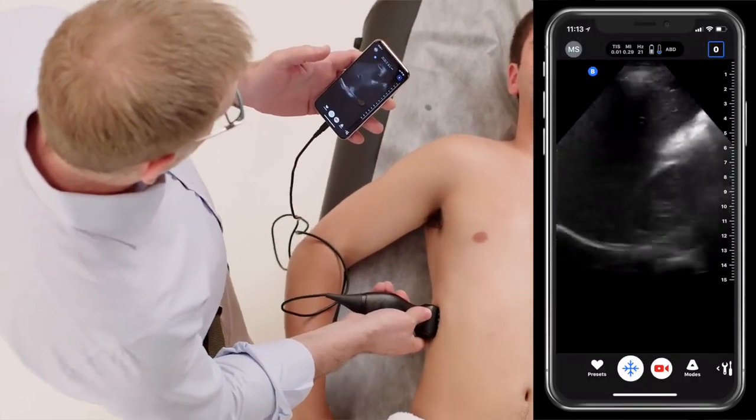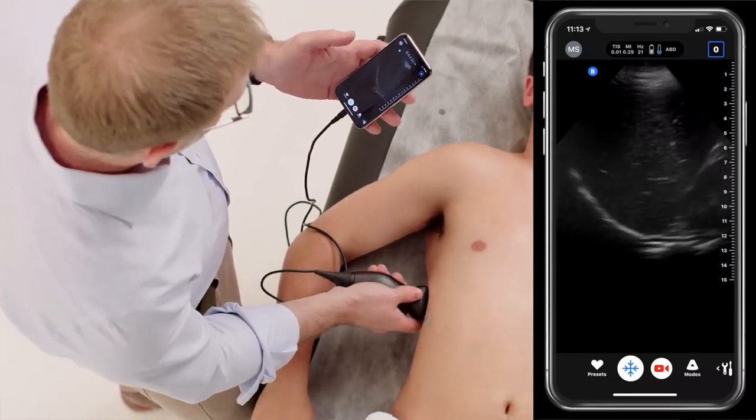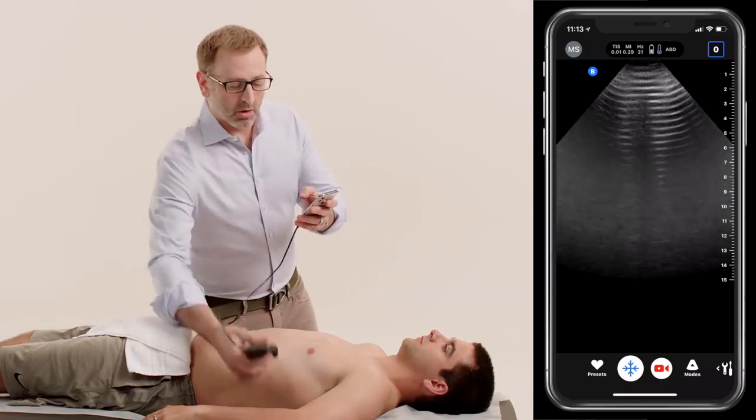We identify the liver, the kidney, we look in Morrison's for any free fluid, we slide up and look above the diaphragm for any fluid in the thoracic cavity. We then move on to the left upper quadrant.